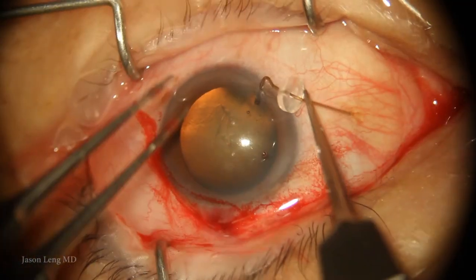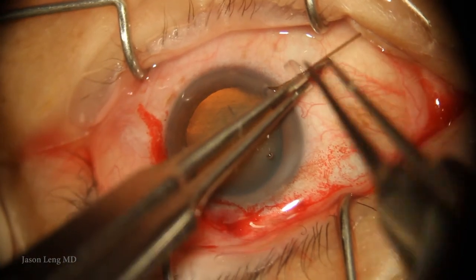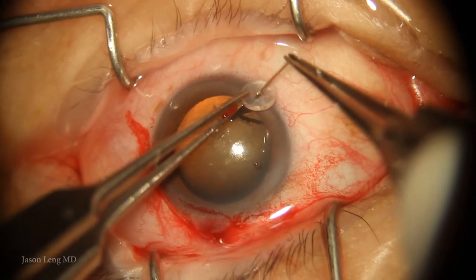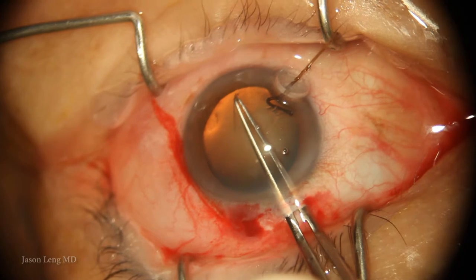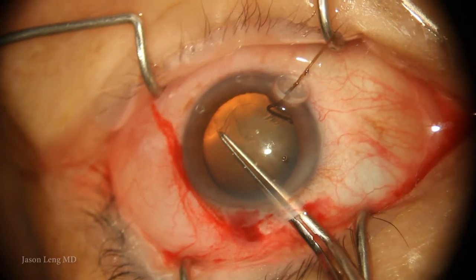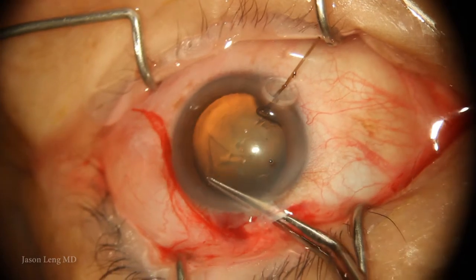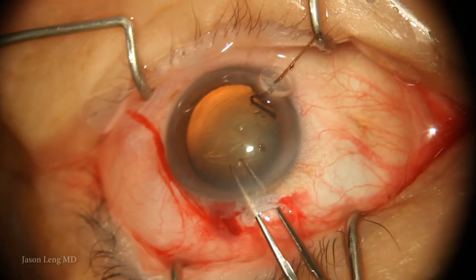I go ahead and place a capsule hook — these are McCool hooks by FCI Ophthalmics. I just need a little counter-traction so I can continue my rexis. And with just that one little hook, I'm able to continue my capsular rexis without much difficulty.